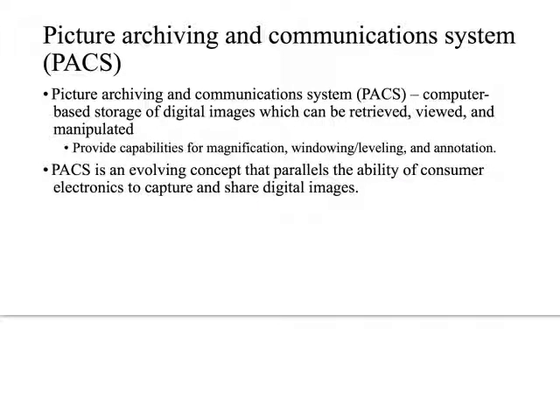Okay, let's get to kind of the gold standard here, which is PACS, Picture Archiving and Communication System. It's sometimes funny. People might say PACS system. That's not really correct. You would say PAC system, but it's PACS if you don't add the word system to the end. So this is a computer-based storage of digital images, and they can be retrieved, viewed, manipulated. You have worked with PACS now for 2 years. It's completely obvious what all it can do.